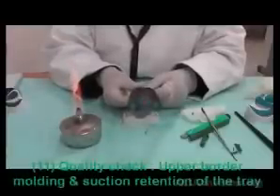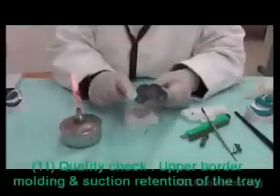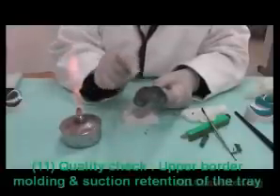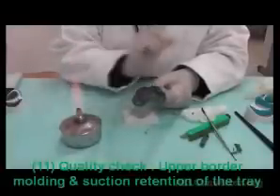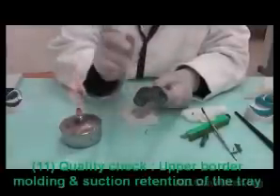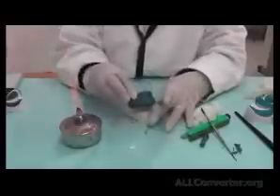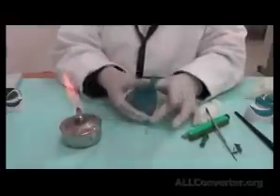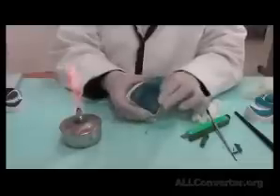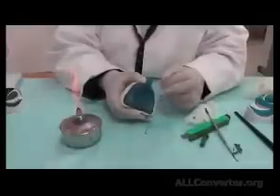We check for its sufficiency in the patient's mouth, but after everything has cooled down, I've noticed that the borders are all there, continuous. The freni, labial frenum and buccal freni are clearly imprinted on the borders. The palatal area is covered. I go inside the patient's mouth and then try to remove it and check its retention. So if it has a good suction into place inside the patient's mouth and I cannot easily remove it, that means we have what we call a border seal.